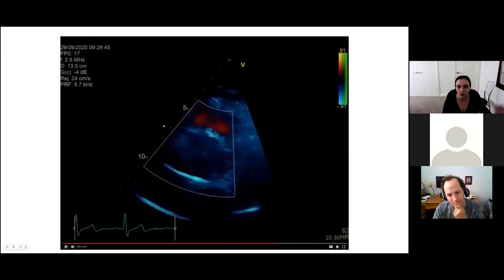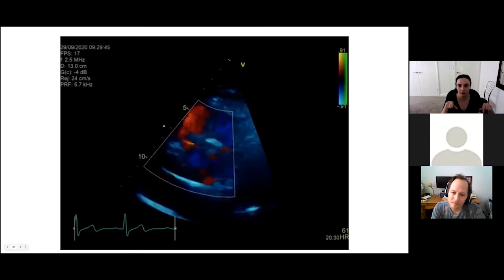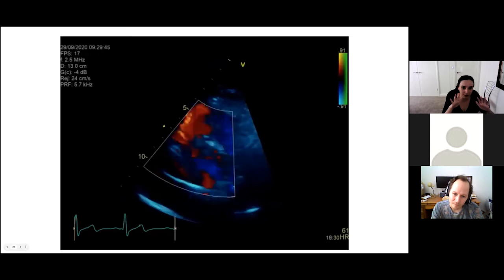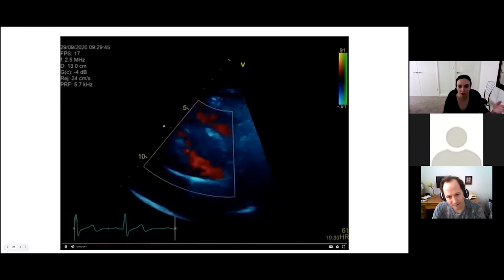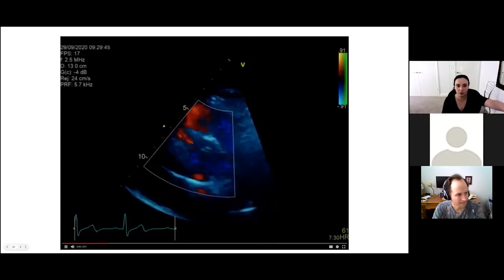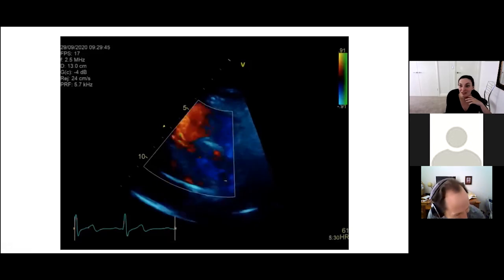So this is a zoomed in view of a short axis at the level of the aortic valve. So just below that, it should be at that Mercedes-Benz sign level, but we're probably just a touch below it. And you can see this little jet coming on the left of the screen. It was right near the tricuspid valve, right? Your tricuspid valve would be over here. It's off the sector on this. So it's an inlet. Is it?